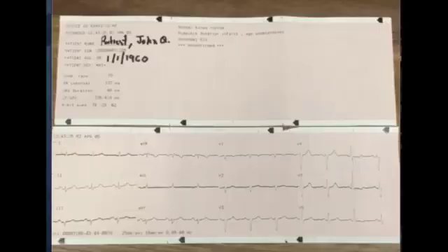Before we send the ECG, we must confirm the data. Double-click or double-tap on the PDF to launch it into full screen. Scroll left to right and up and down to view the page data and all lead tracings.